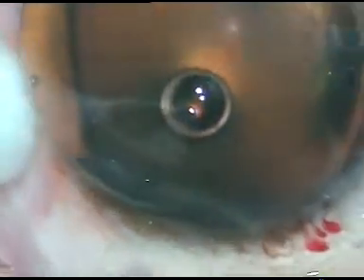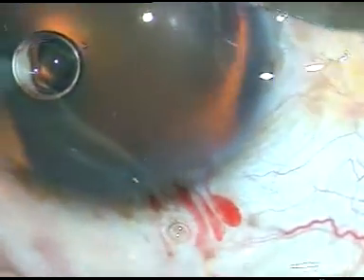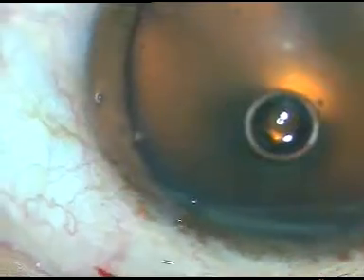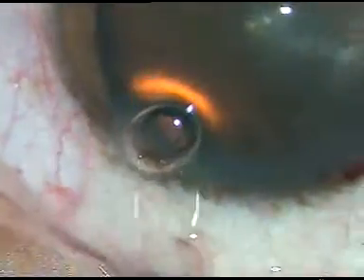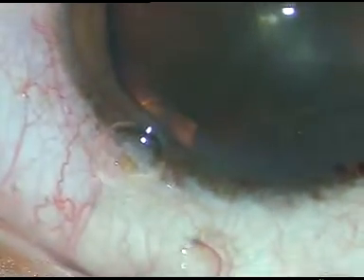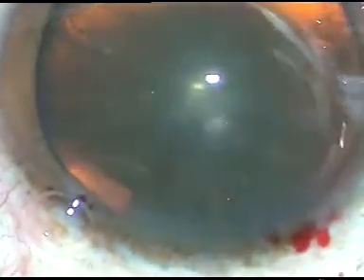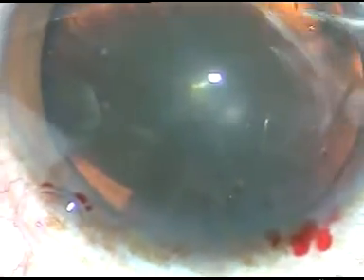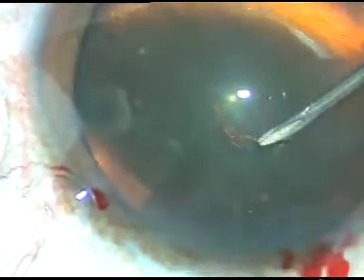This is a side port on the right side of the main incision, and this is another side port on the left side of the main incision. The patient is under topical anesthesia. The eyeball is not held with any tooth forceps — it is supported by a cotton-tipped pad and all the manoeuvres are done.